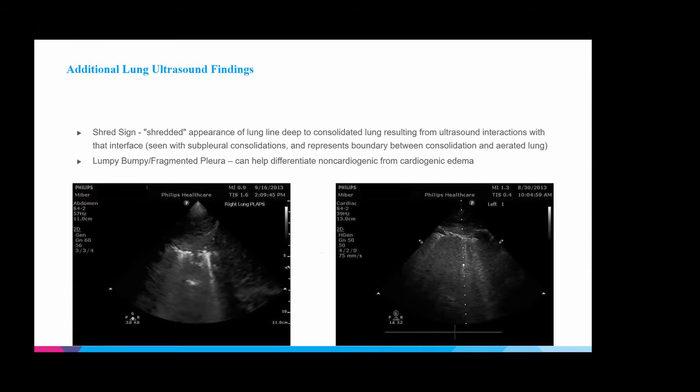All right, so we sort of raced through that quick lung ultrasound review. I think what we're going to do next is run through a series of cases. It's just 5 cases, and we're just going to walk through them. Depending on what you guys think of the images, you may get them pretty quickly or not. Some of these are real cases that we've encountered on the ultrasound elective, and some of them I had to make up. So if they don't make sense, I apologize. I didn't have a vivid imagination, but maybe I can tweak them for the next one. All right, so let's go to the first case.